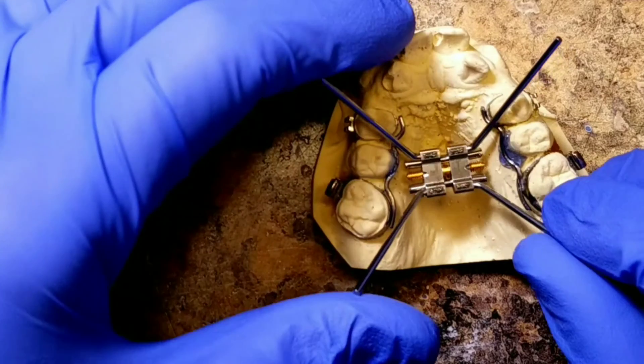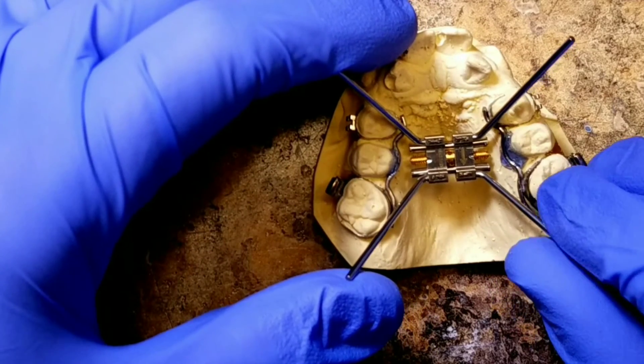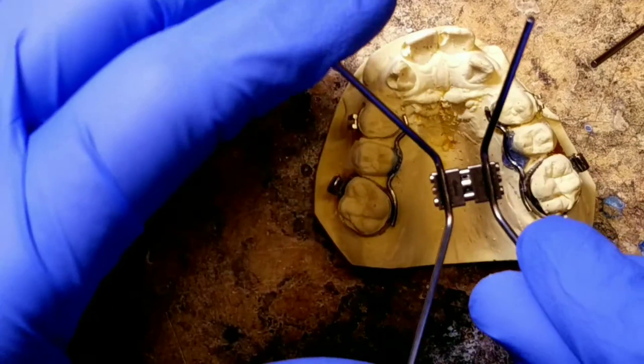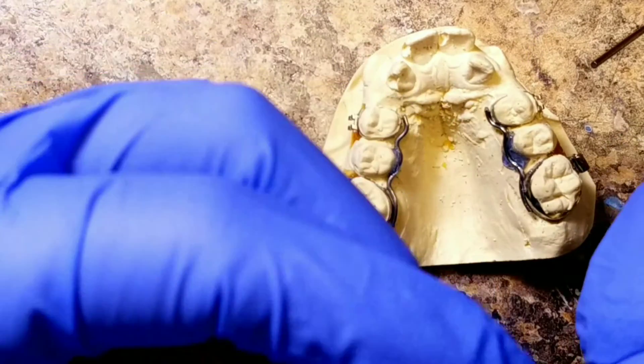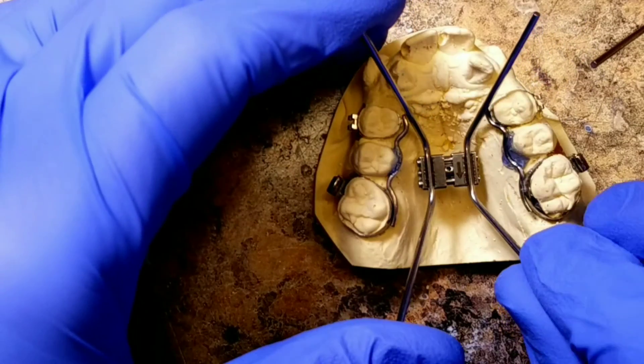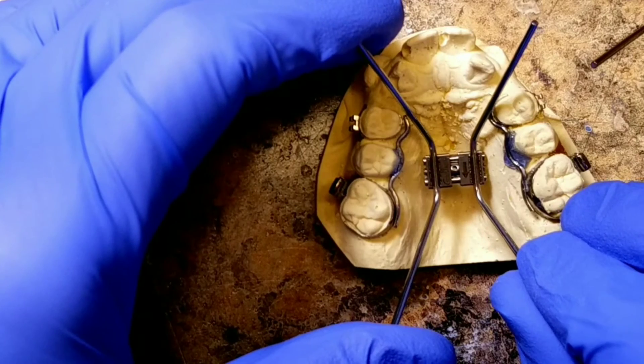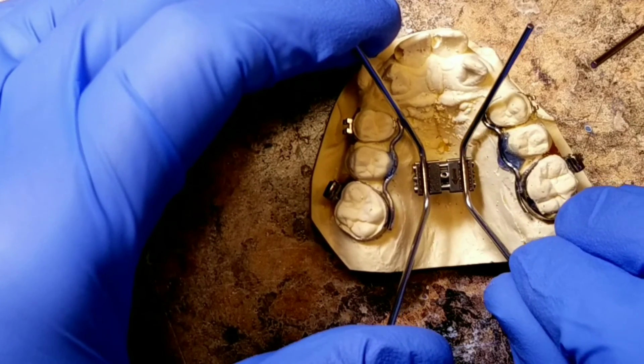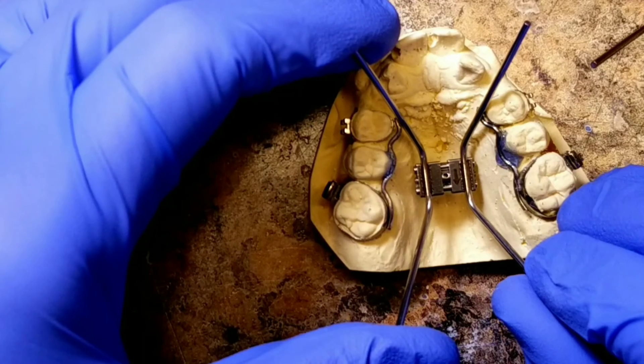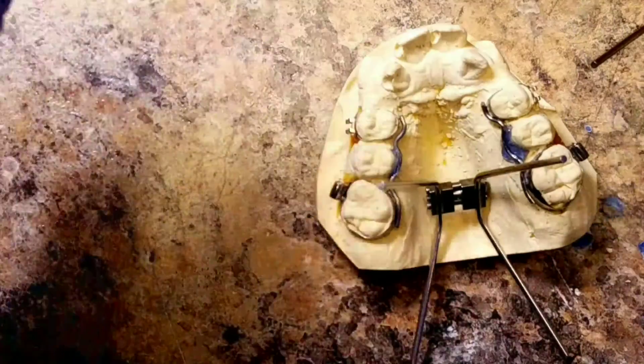There's two ways to handle this problem, and the first one is very simple. You would buy a smaller screw. You can get a 10 millimeter screw and drop this thing down right in the palate where you want it to be, bend the arms, and you're still going to have enough room for clearance when the palate opens up.